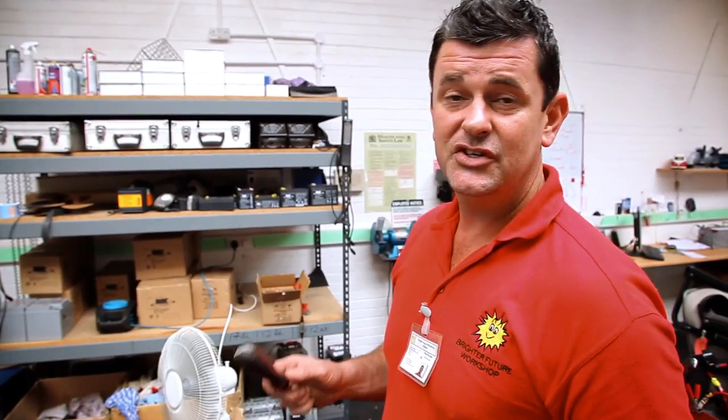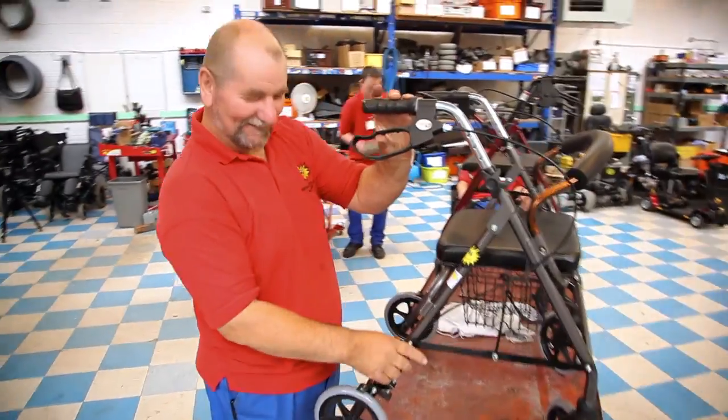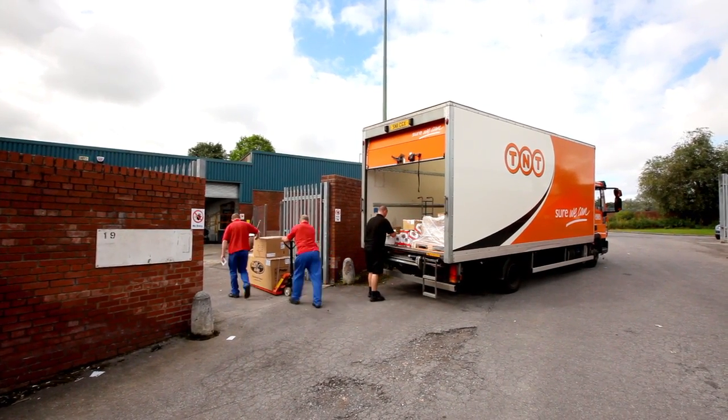In the workshop, basically, we've got 4 full-time technician stations. Each one's got a specific skill. The electronics, for example, we've got a mechanical engineer here, we've got a wheelchair guy. We've got 2 guys now who are out on the road picking up repair work, donations of equipment, and we don't know what's coming in tomorrow. So we may use 2 or 3 different scooters to refurbish one complete scooter.